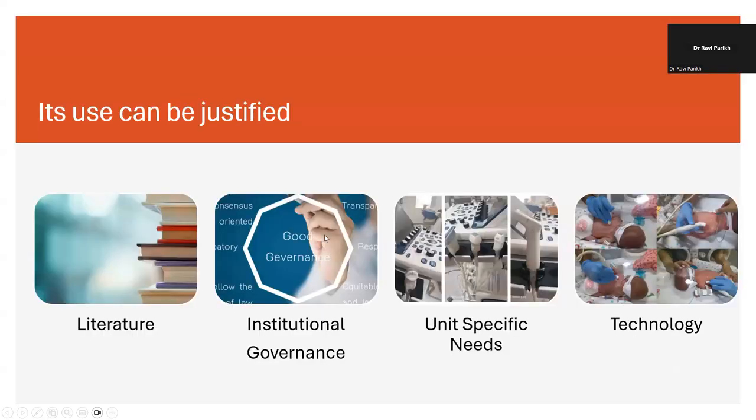Now, what I do want to say is that lung ultrasound gives you a lot of information. There is a huge amount of literature that justifies its use. There is institutional governance that is in place, now prescribed in the article by the American Academy of Pediatrics, by the European Society of Pediatric and Neonatal Intensive Care. And really, by international bodies, NeoFocus UK, the Cactus Group, all of which basically allow us to train using good governance to be able to implement lung ultrasound as a diagnostic modality in our unit.